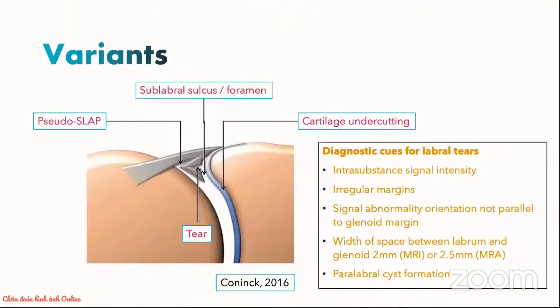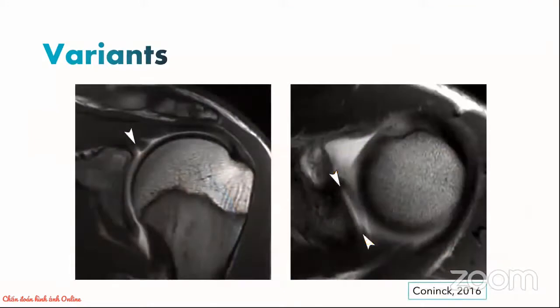Do be aware that there are morphological findings in the glenoid labrum that look like tears but actually represent normal variants. This includes sublabral sulcus, sublabral foramen, pseudo-SLAP, and cartilage undercutting. If you follow the diagnostic cues for diagnosis of labral tears described earlier, you should be able to differentiate variants and tears with confidence. For example, in these coronal and axial MRI arthrogram images of the same patient, we see a thin, smooth fluid cleft in the superior labrum that parallels the glenoid margin in orientation and does not violate the labral substance. This is interpreted as a sublabral sulcus rather than a superior labral tear.